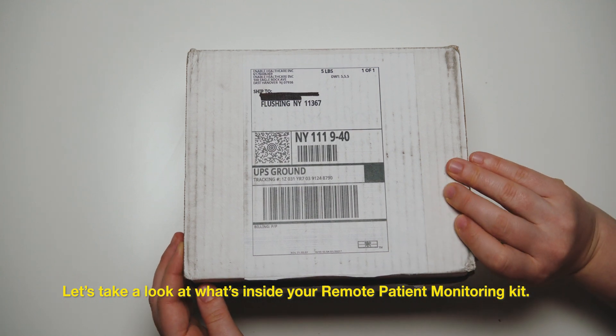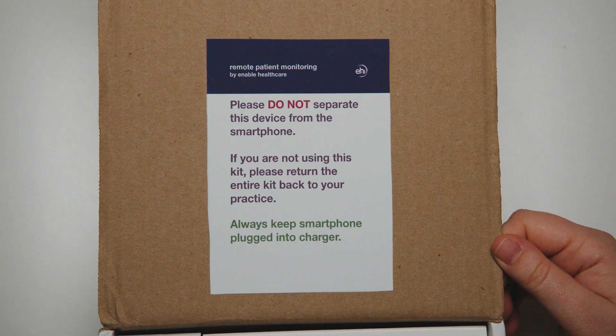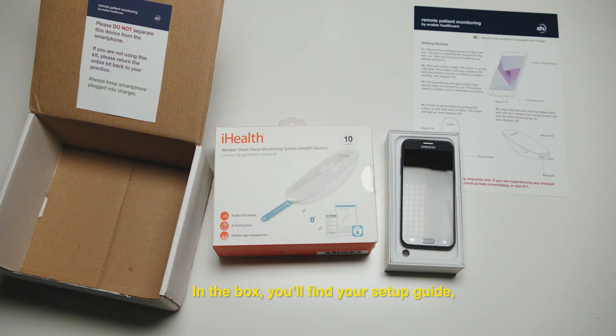Let's take a look at what's inside your remote patient monitoring kit. In the box, you'll find your setup guide, your medical device, and a smartphone. Both your smartphone and medical device have been set up for you.